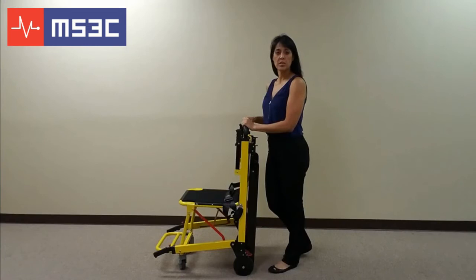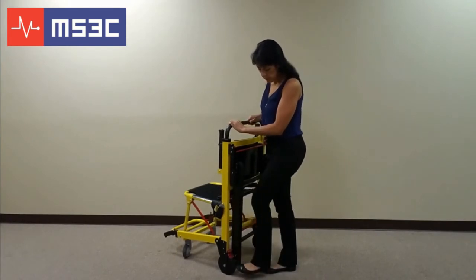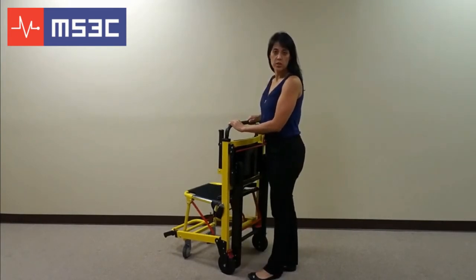The 300TS comes standard with locking casters. To lock the casters, push the red lever located on top of the wheel. To unlock the casters, simply push the top red lever located on top of the wheel.